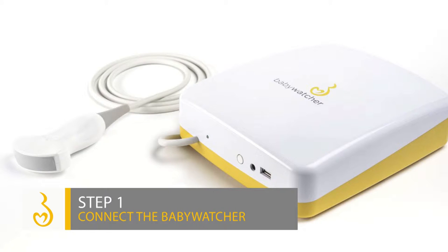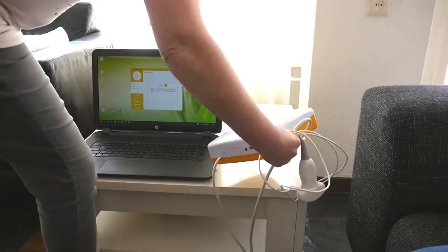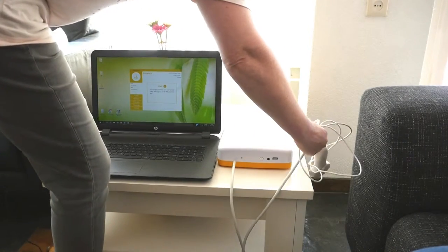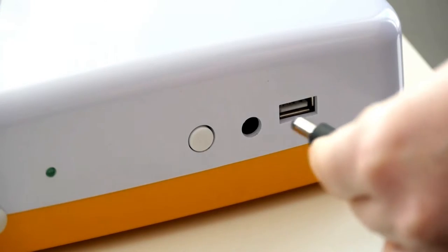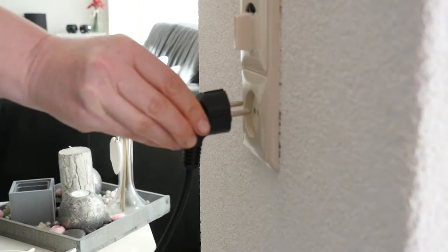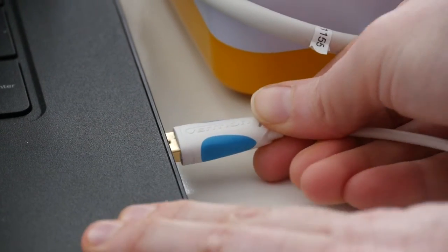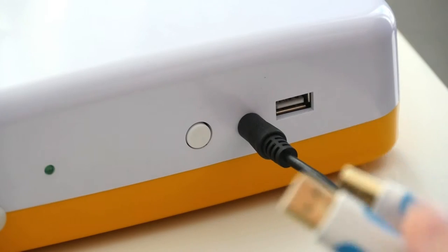Step 1: Connect the Baby Watcher. Place the Baby Watcher on a flat surface. Plug in the adapter of the Baby Watcher. Connect the Baby Watcher to your computer with the supplied USB cable.